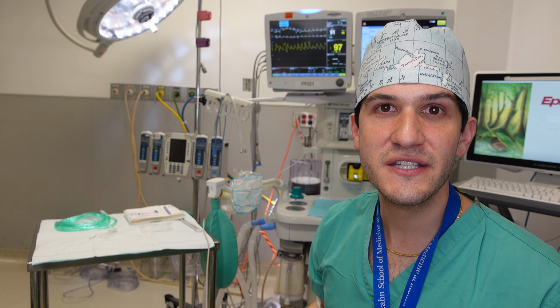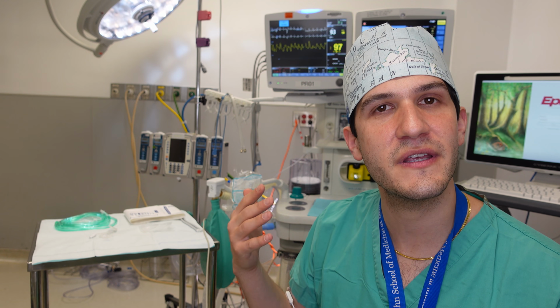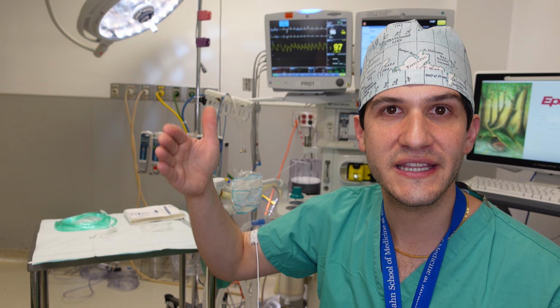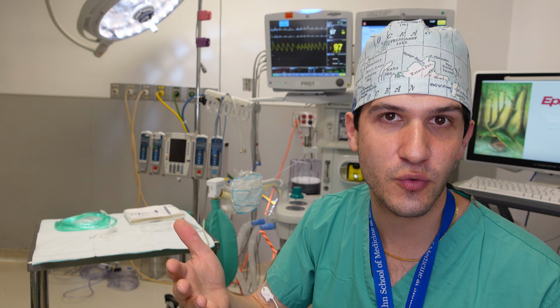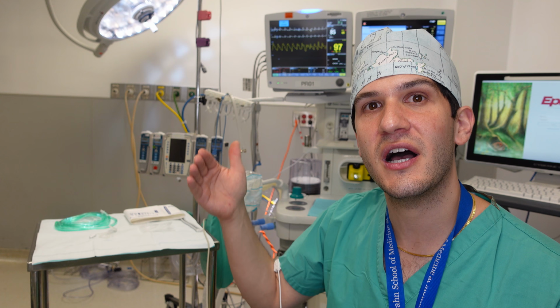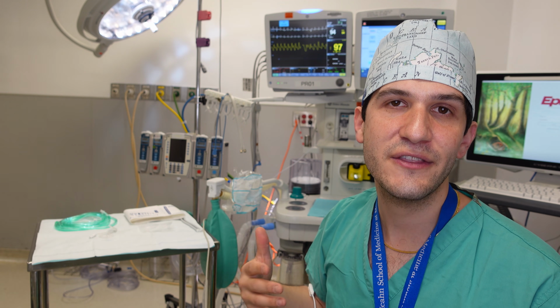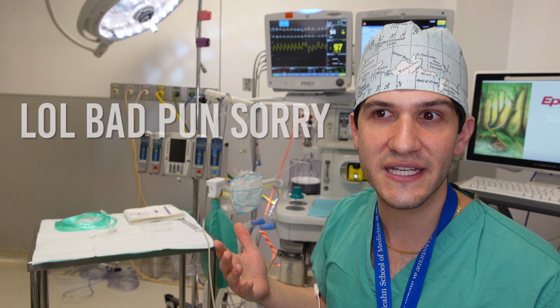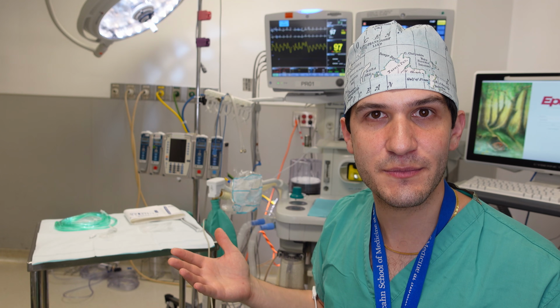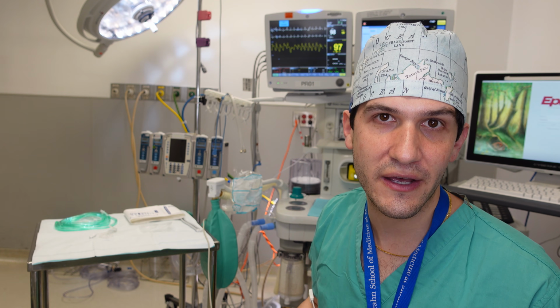So as you'll notice, this device actually makes sound, and there are two components of the sound that I'm listening for. Both of them are extremely important for me as I'm taking care of a patient. One is how frequently that tone is going, which gives me a patient's heart rate, and the other is the pitch of that tone. So if a patient's oxygen saturation starts to go down, then the pitch of this tone also starts to go down. And the reason why this is so vital for me is because it allows me to look away from the monitor, start taking care of other aspects of patient care, and still have an understanding of what's going on with the patient without having to look at the monitors.